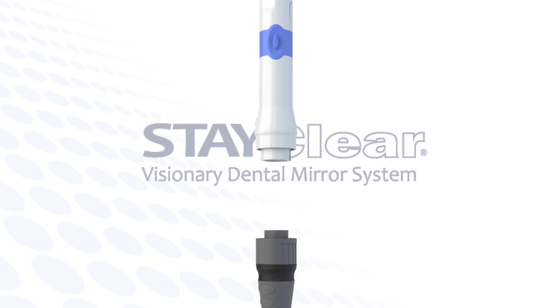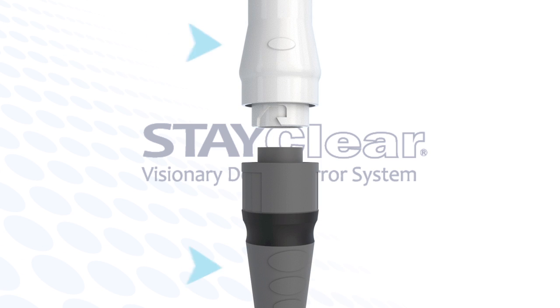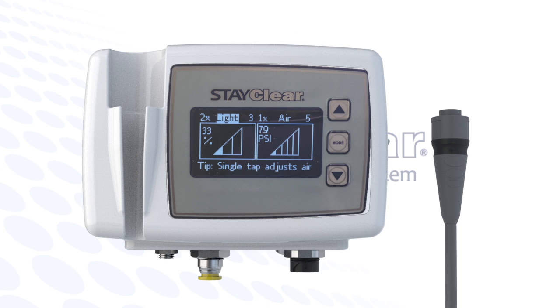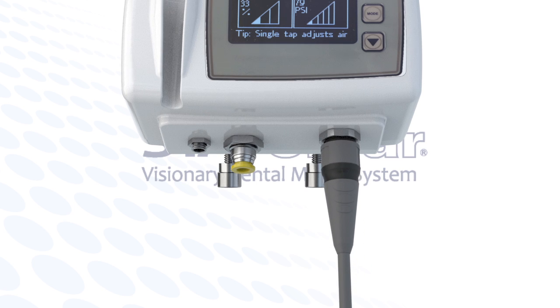The umbilical attaches by aligning the interconnect into the back end of the handpiece. You align it with the marks shown here. Now, firmly push the umbilical into the handpiece, and the umbilical and handpiece will lock into place. Now, use the same alignment technique to push and lock the other end of the umbilical into the computerized display and cradle system.